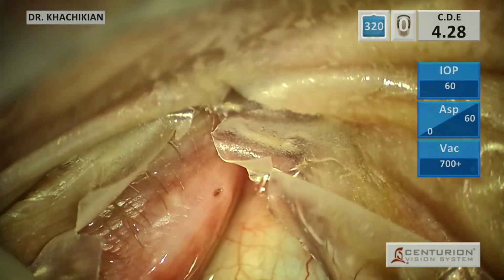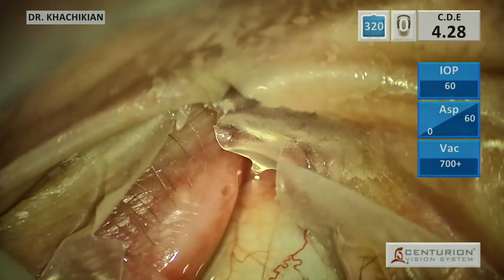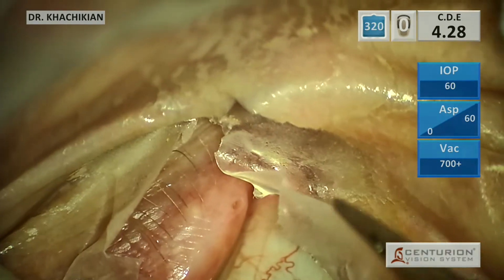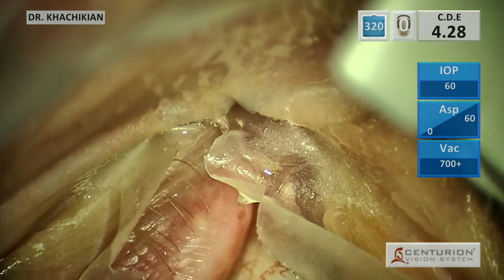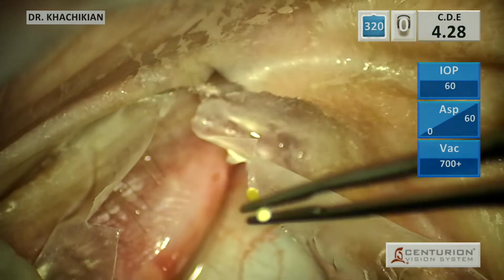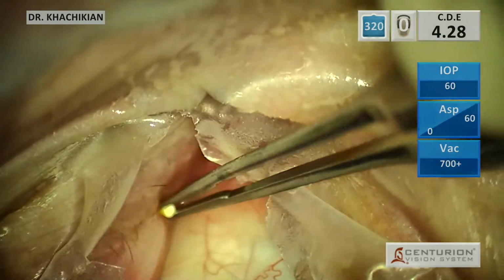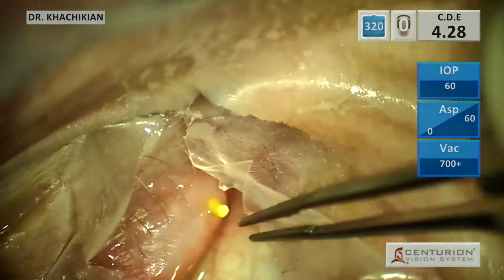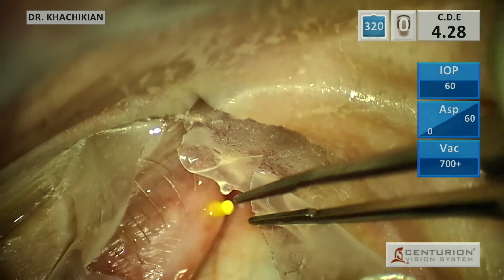Once it's been dilated, we will try and make sure it's relatively dry and then grab the Dextenza. If the punctum is really wet, then the Dextenza expands fairly quickly and it becomes more difficult to get it in. And you'll actually kind of see that here. I grab the Dextenza with the forceps and place it in the punctum, and usually I'll grab it more vertically than that. I kind of grasp it perpendicular, and I try not to do that. Usually I'll grab it more vertically. As you can see, it has swollen, and now it's hard to get in.